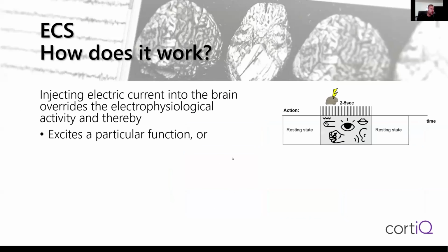So how does this now work? We have a resting condition, and then stimulate for 2 to 5 seconds with a 50 Hertz train. This is also called the Penfield method, and then we will see, for example, the patient will see a visual illusion, auditory illusions or induced speech, perception on the oral parts, or hand contraction, finger movement, leg movement, or also a sensation in the fingers.